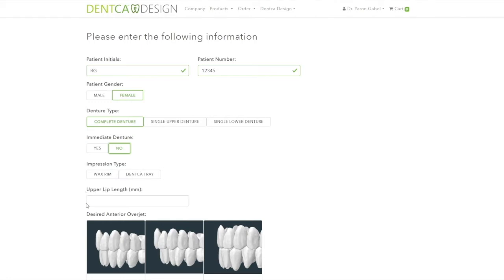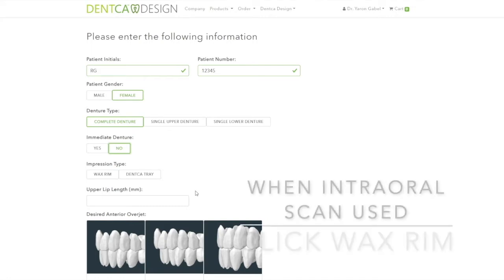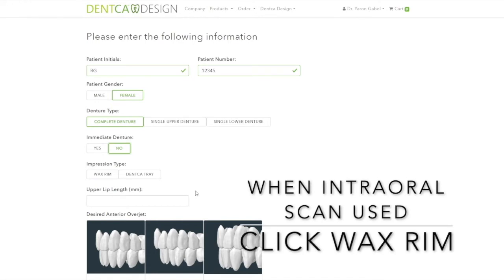It is very important to select the correct impression type: Denka tray or wax rim. If you select Denka trays, it will ask for the upper lip length, which can be obtained during the impression appointment with the Denka lip ruler. If you are designing a single arch mandibular with a Denka tray, please enter an arbitrary number from 1 to 10. For any other cases with intraoral scans or stone models, select wax rim.